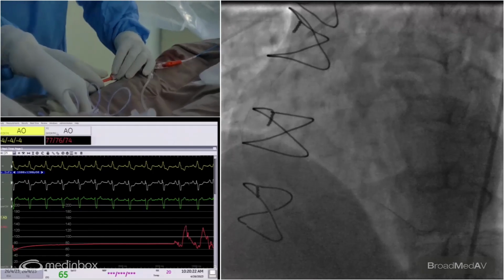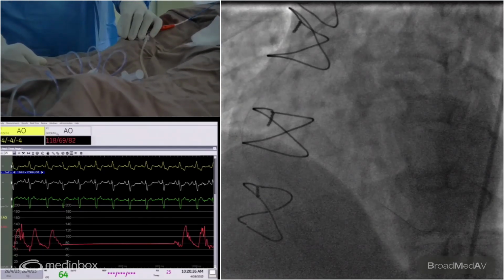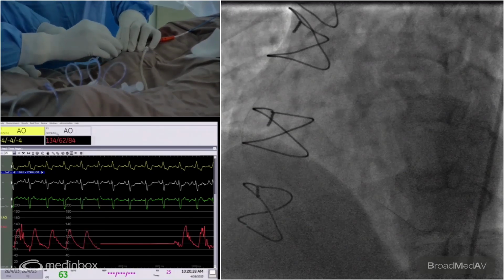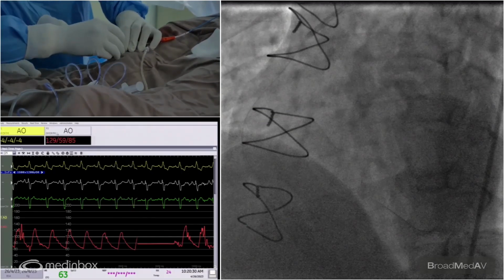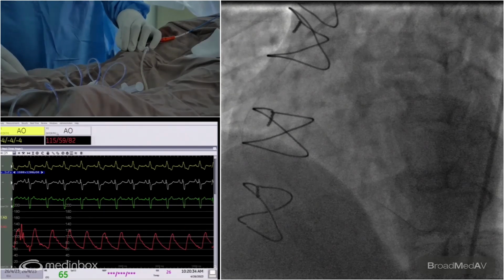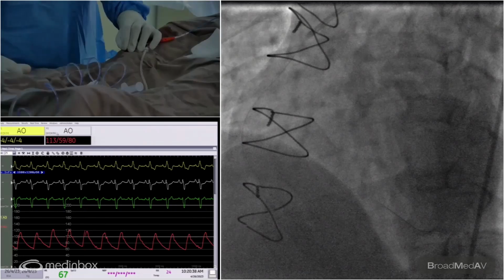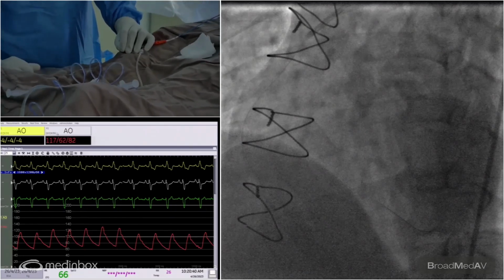Okay, so we're riding now distal. This is a 0.014 Sion blue wire, crossing distally. It's not a challenge. So we are taking a non-compliant 2.25 into 12 millimeter balloon to pre-dilate, as we won't be able to cross the IVUS as it's a significant critical stenosis.